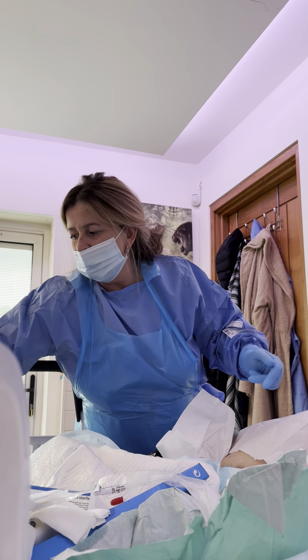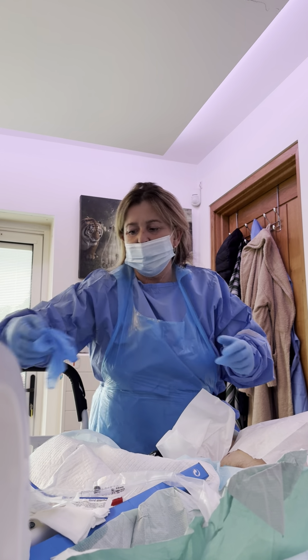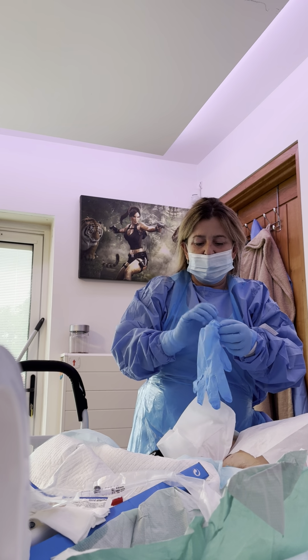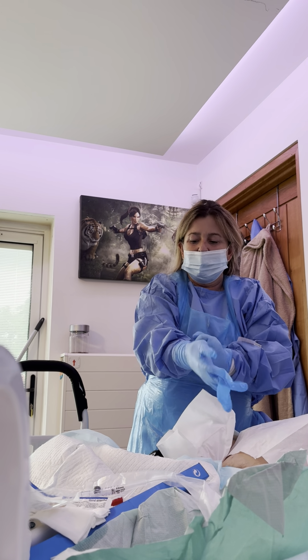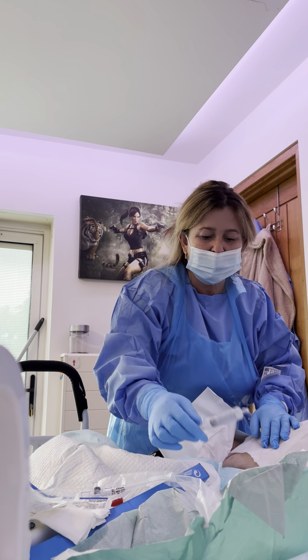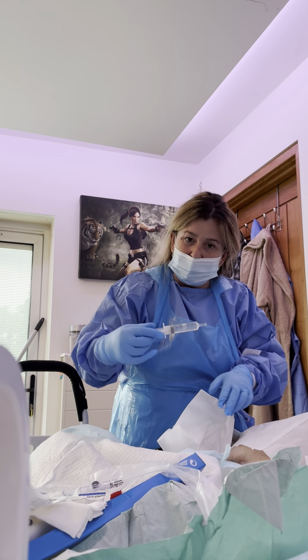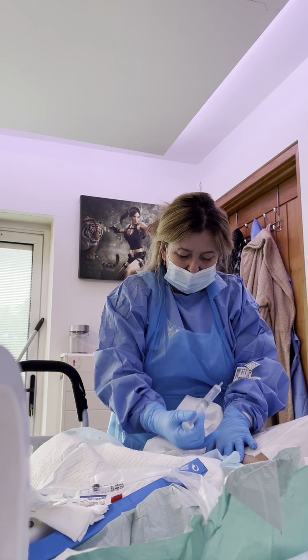I'm ready now. Are you okay? Are you ready for it? Yeah. I've got gloves everywhere. So I'm going to be popping the instillagel in. So here's the instillagel. Like I said, I've got everything ready. So this instillagel goes straight into the actual stoma site.